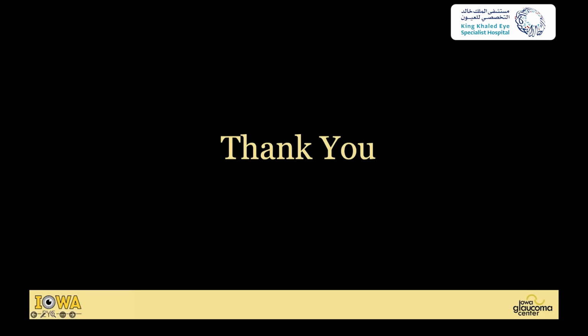Excellent, thank you. And I think Dr. Bassey's idea of this blue donut is important. She does surgery on our patients who are as young as 9 years old, and we don't know what trypan blue is going to do to a 9-year-old lens. So she puts this dollop of viscoelastic and carefully protects the lens before she drives up the pressure and pushes this trypan blue into the angle. I think that's a really, really important step.